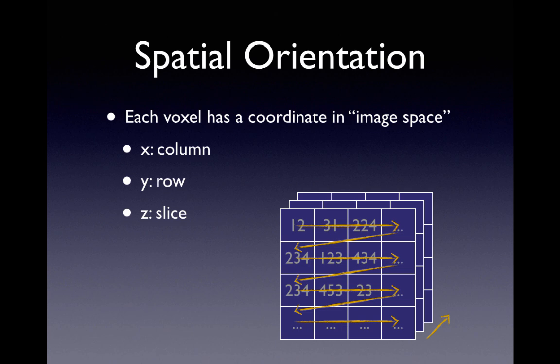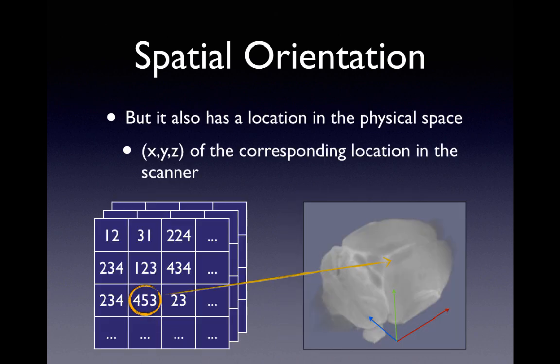So, for example, in MRI, we might acquire a FLAIR scan axially and a T1 MRI scan sagittally. So, in two different scans from the same MRI session, this encoding of how the directions in the image array map to directions in physical space will be different. And if we don't capture that information, or somehow that information gets corrupted as we're changing image formats, then we're no longer going to be able to correctly line up the T1 scan and the FLAIR scan. So this is showing that every voxel, every location in this three-dimensional array, can be mapped to some location in some physical coordinate system, which is defined relative to the scanner.